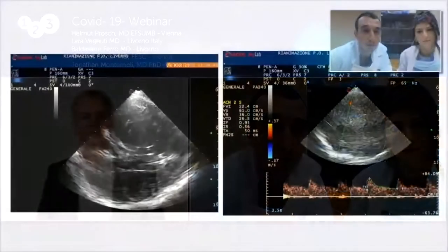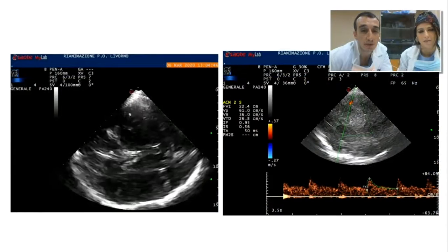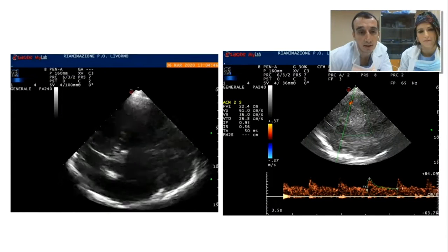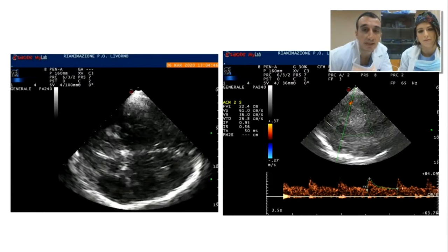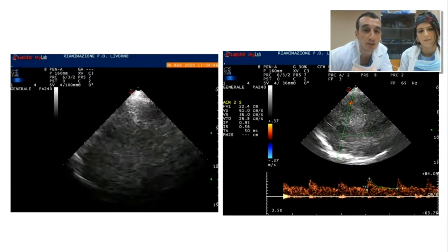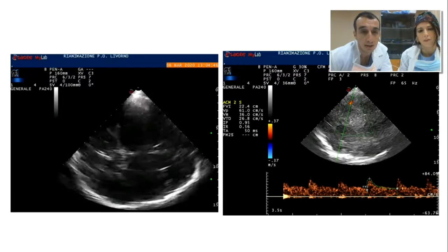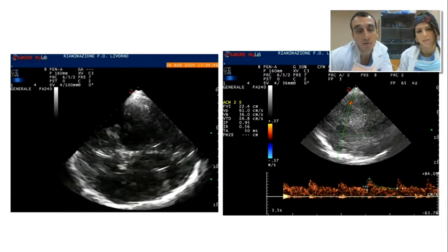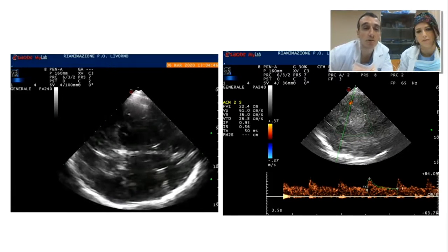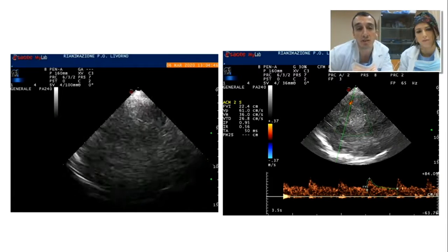Yeah, I guess there's one more thing that you wanted to mention about the role of ultrasound, right? Yeah, because when we had a patient in coma after COVID infection, and when you have to do a CT scan of the brain in this patient that is indicative of a stroke or other pathologies, it's difficult. It's very difficult. And when you have a good temporal window, you can use ultrasound to do a differential diagnosis of hemorrhage in the brain.